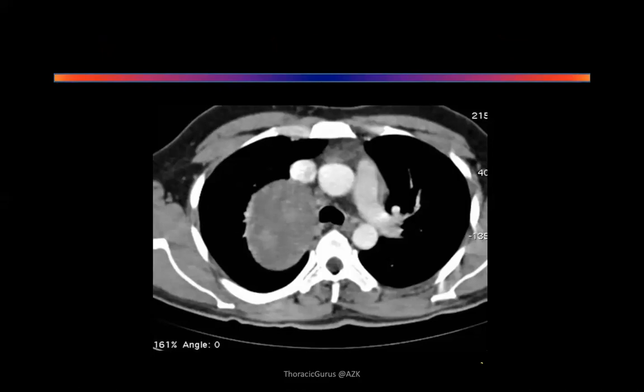Can you say? Yeah, Vithun, what do you want to call it? Sorry, could you say sequestration for that one, for the X-ray one? Possible. Anything is possible on a chest X-ray. Very difficult to say that. But cyst is more common because the consistency was more cystic. Okay, Nikhil, stay with me and just describe this one to me.